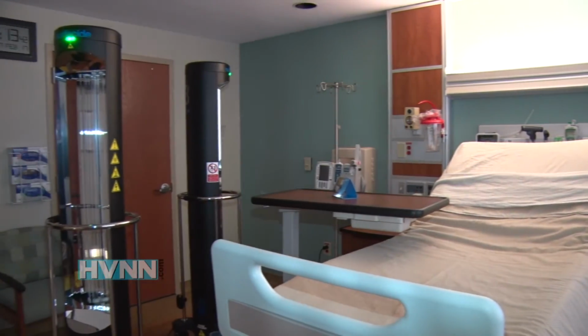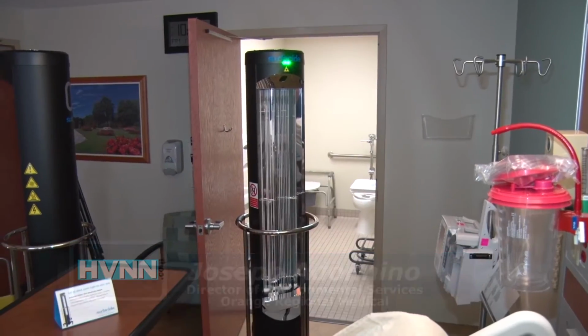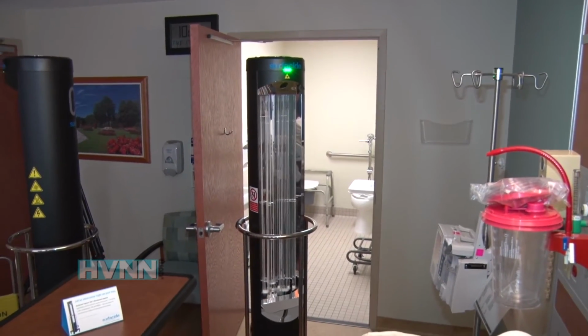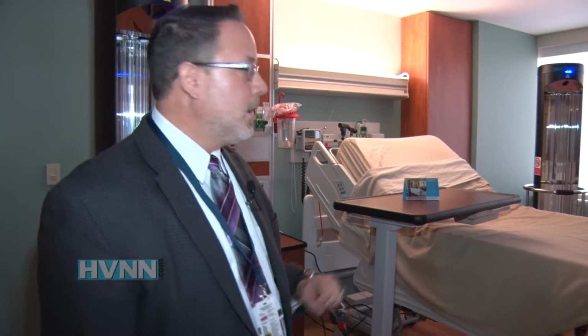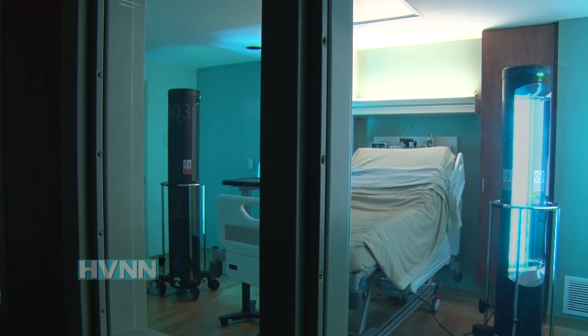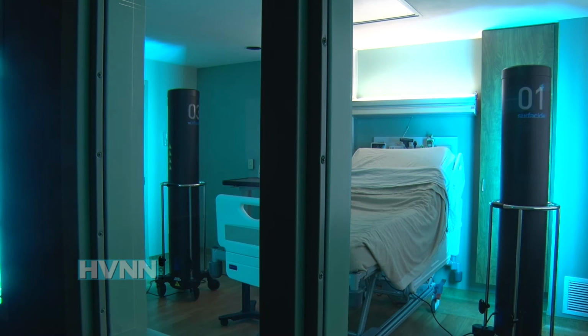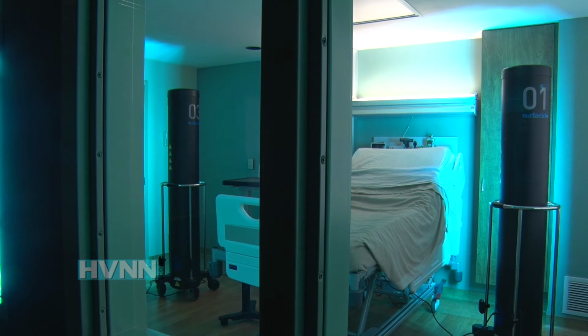As you see, we have in strategic locations within the patient room our 3-tower system. One is definitely pointed towards our bathroom because that's important. The other 2 get the remaining contents of the room. The towers work in conjunction. They map the entire room and the entire contents within the room. Once that process is done via a tablet, which takes about 90 seconds, we are ready to engage the system.